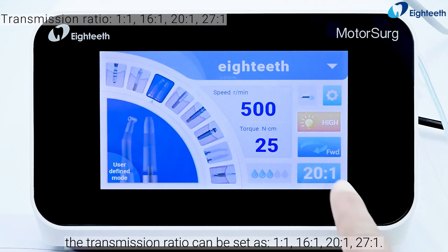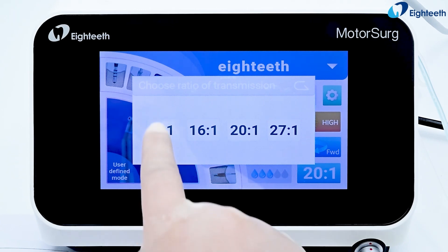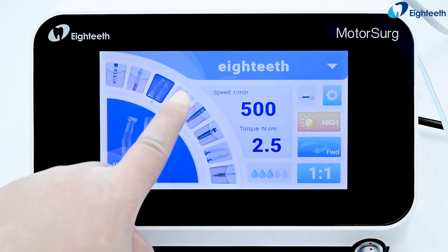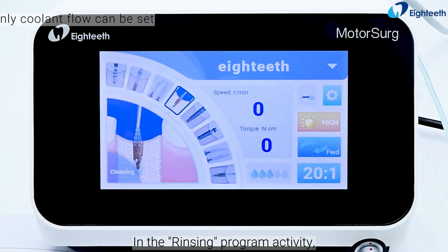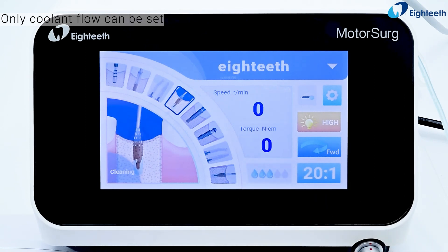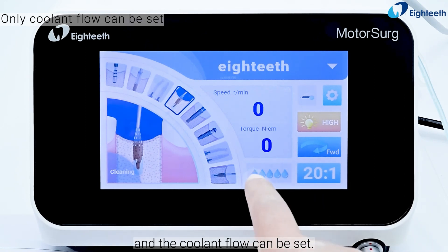In the free use program activity, the transmission ratio can be set as 1 to 1, 16 to 1, 20 to 1, or 27 to 1. In the rinsing program activity, the speed and torque are 0 and only the coolant flow can be set.